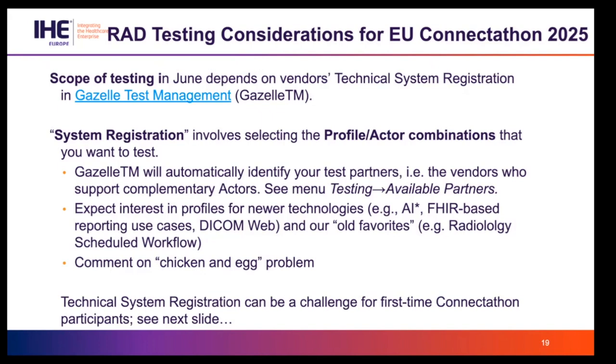And when you register those, our Connectathon test management tool, which we call Gazelle, partners you with the complementary actors. So you might be on the client side of a transaction, other vendors may be on the server side of the transaction, and Gazelle Test Manager helps you see available partners.